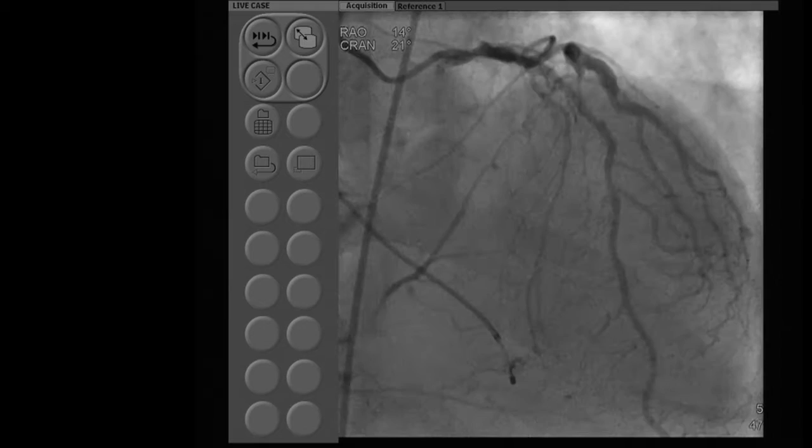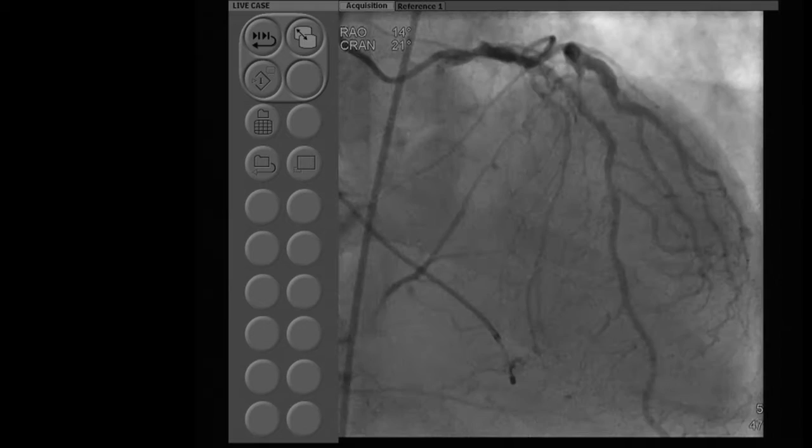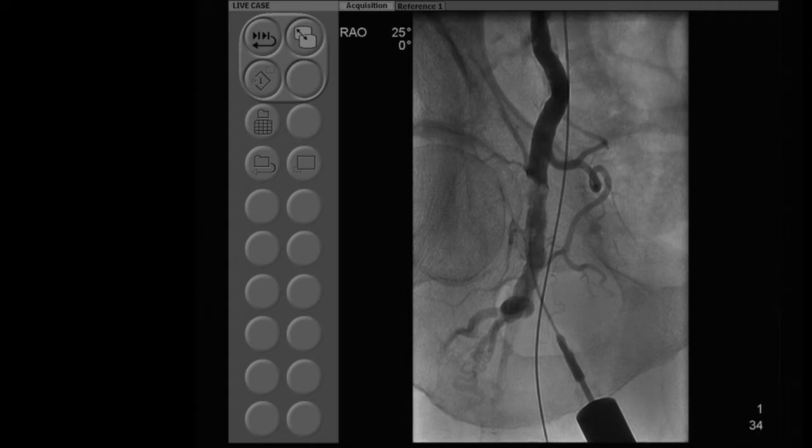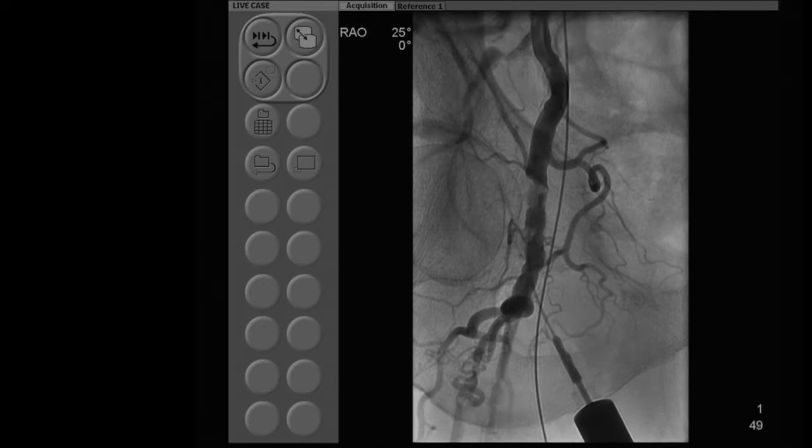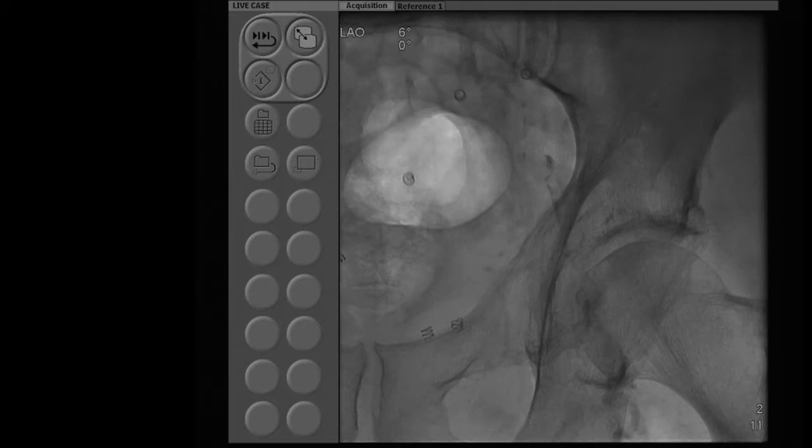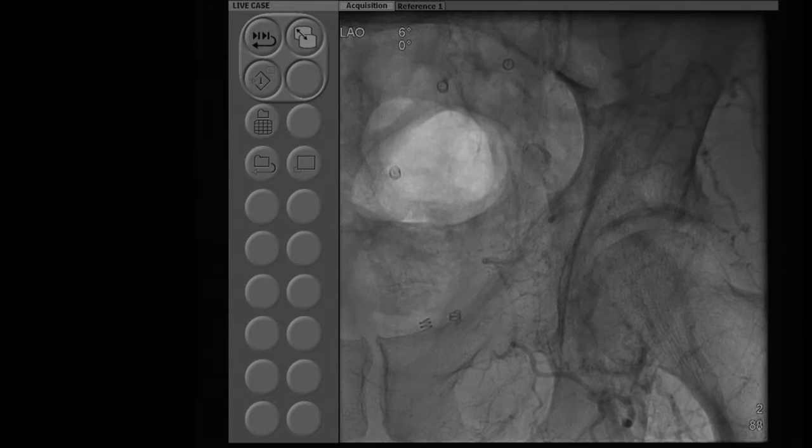Fortunately, the EF has been preserved. But there is 4-plus calcification and extremely challenging access. Looking at the access view — heavily calcified right side — this is a case where you can't even use Perclose; Perclose surgery is not going to work. So we went to the contralateral side, and that is where we are.